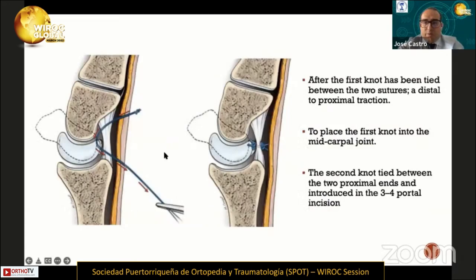Finally, we perform the knots. The first knot is tied between the distal sutures, as we can see in this image, and then the first knot is introduced into the midcarpal space. Then the second knot is tied between the two proximal ends and introduced through the 3-4 portal incision.